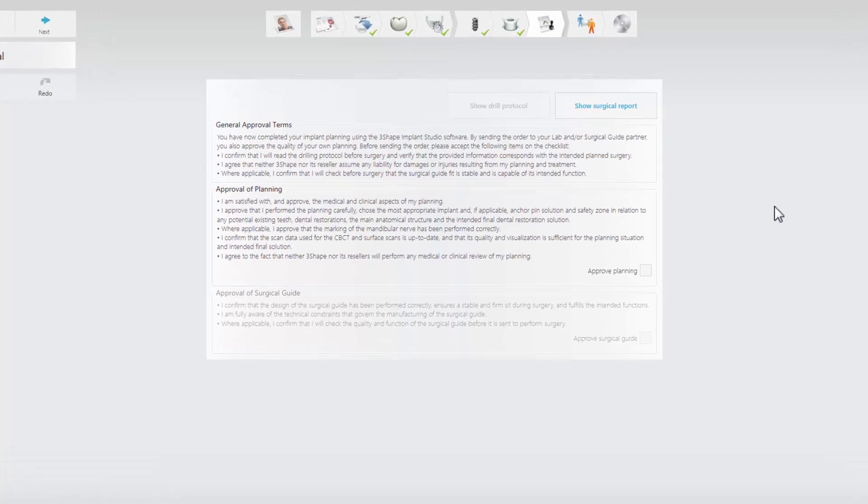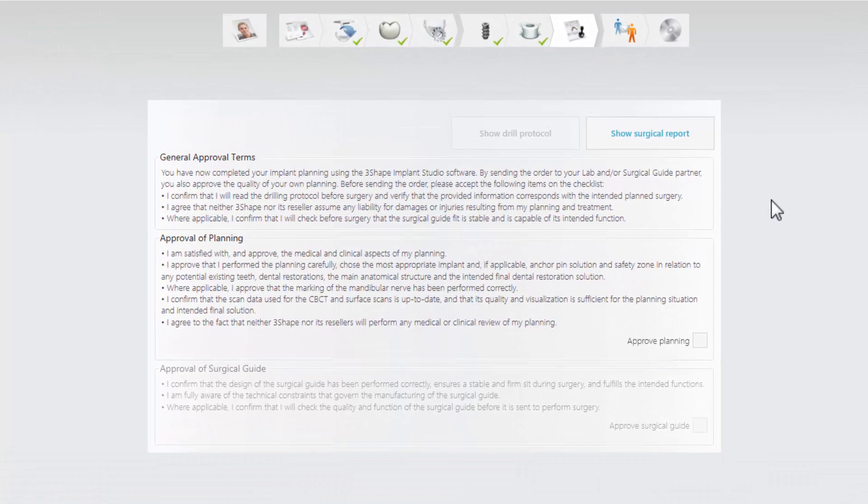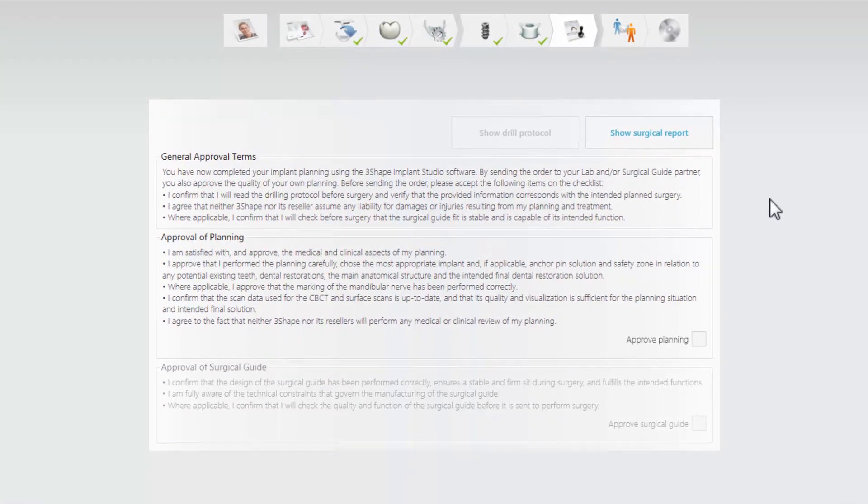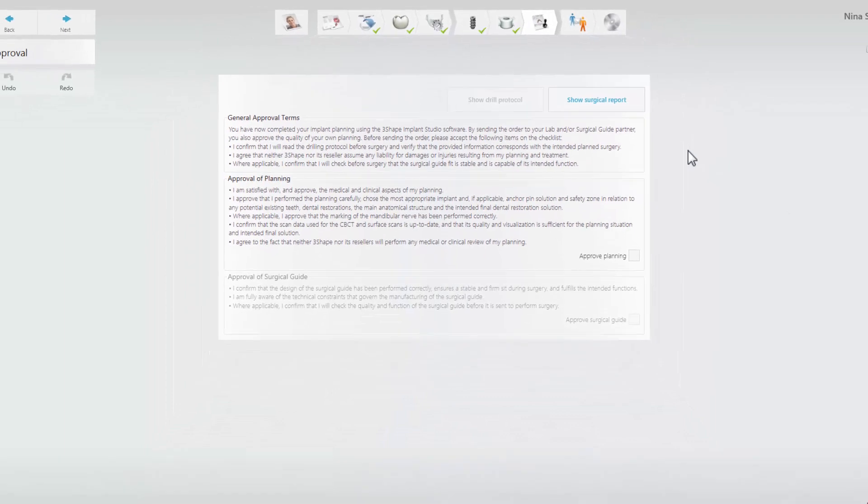Please read the approval carefully. It states that you are responsible for the planning and guide design and that everything has been carried out with the required amount of care.